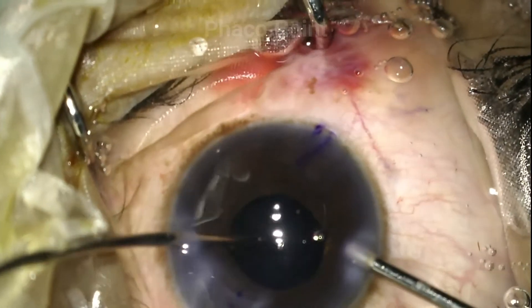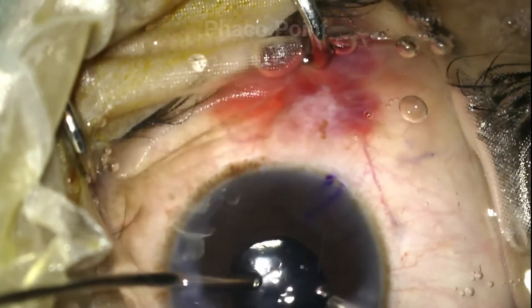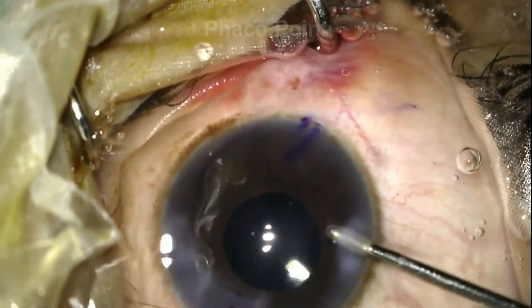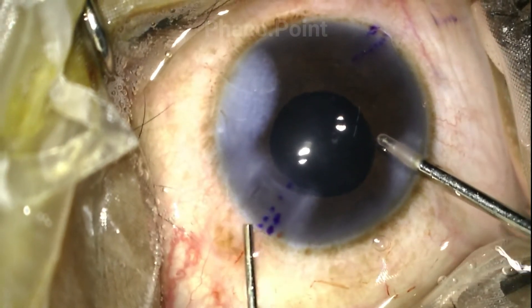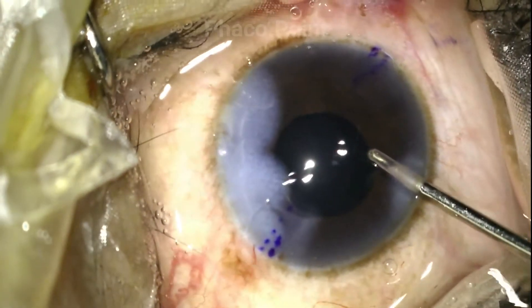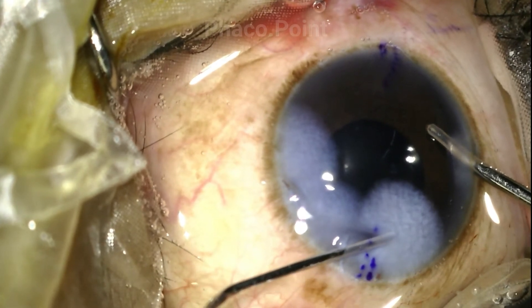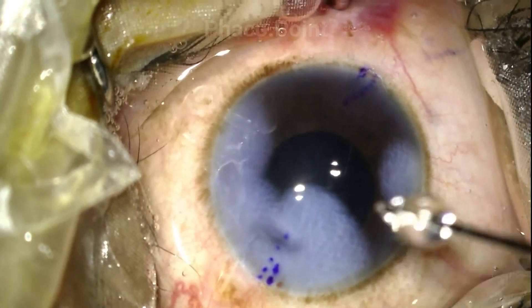Finally, the surgeon moves to hydrating the wounds. One needs to take significant care while hydrating these wounds because you don't have a stable wound — you've got a flap in the upper lip of the wound, and therefore that might make hydrating slightly difficult. First, it is the left end of the wound that is hydrated, and finally, with significant care and caution, the surgeon hitches into the right anterior end of the wound and hydrates it too. This is followed by hydrating all the other wounds.